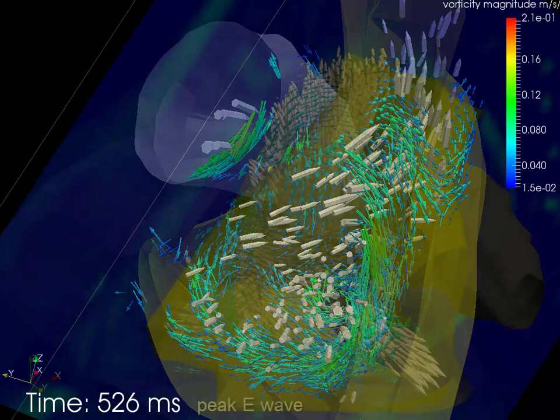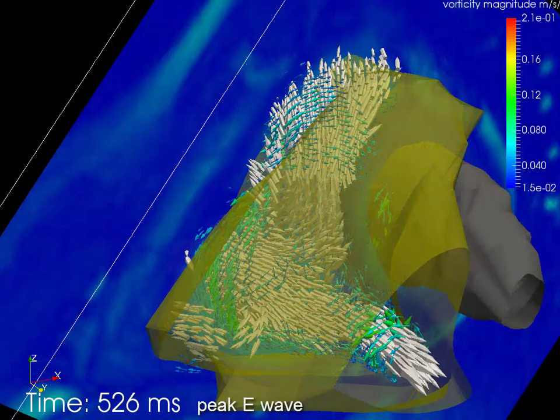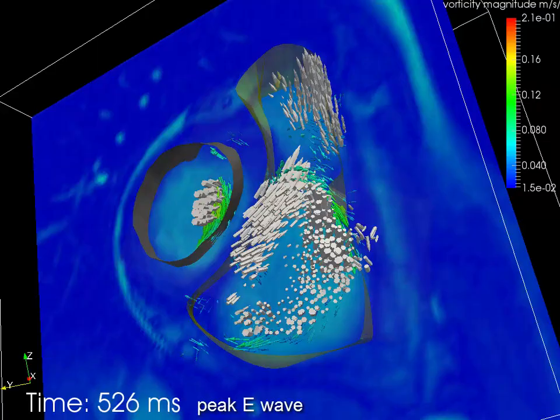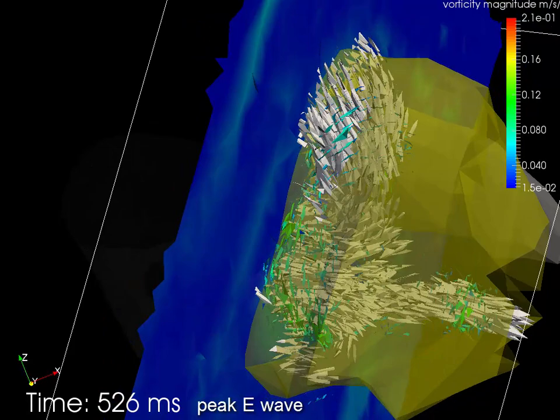Let's turn all the velocity vectors back on. Now we can see that flow is wrapping around the leaflets in only a few locations. In particular, we see no flow around behind the anterior leaflet.